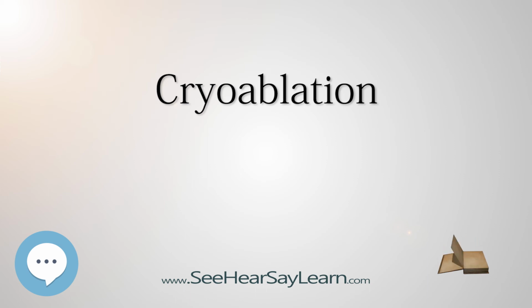CT, MRI, ultrasound-guided cryoprobes became available and improved the capabilities of cryoprobes in treatment. Excited by the latest advancements in cryotherapy, China embraced cryotherapy in the 1990s, to treat many oncological conditions. With the benefits well established, the FDA approved the treatment of prostate cancer with cryoablation in 1998.